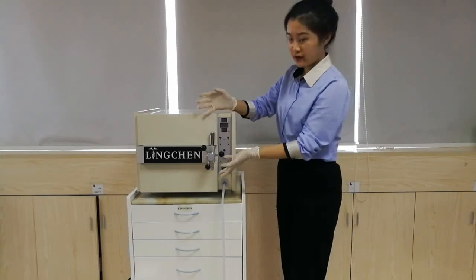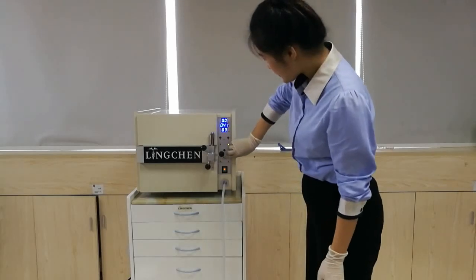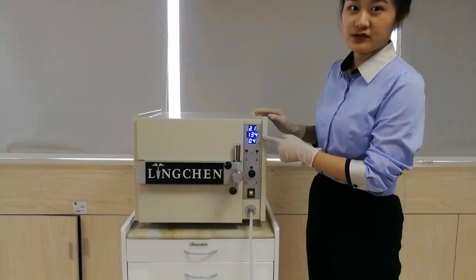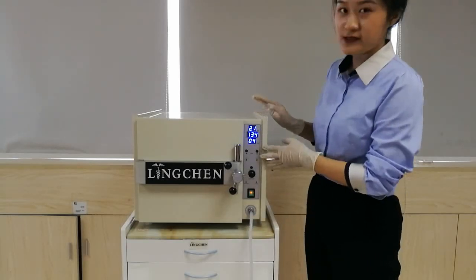Make sure it closes well. Open the switch and press start. Now is the heating time — the temperature keeps raising. When the temperature reaches 134°C and the pressure reaches 2.1, it will start to sterilize for four minutes. Now the pressure is 2.1 and the temperature is 134 — it's starting to sterilize.